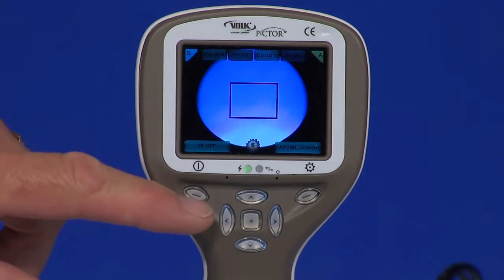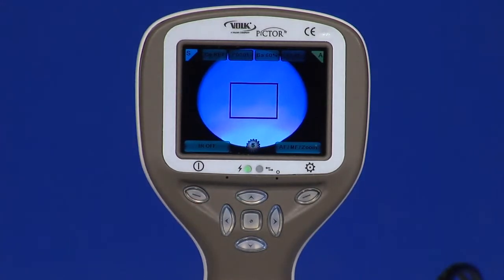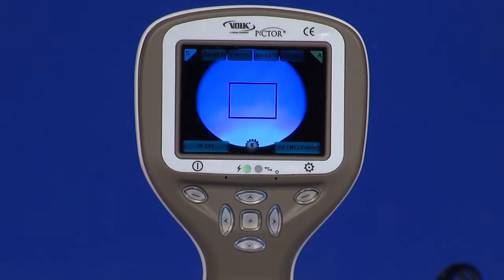Left soft key. There are two functions for the left soft key. The aiming light, selected as infrared or white, can be turned on and off. The aiming light can also be turned on by half-pressing the shutter button. The camera is powered on and off by pressing the left soft key for longer than 2 seconds.